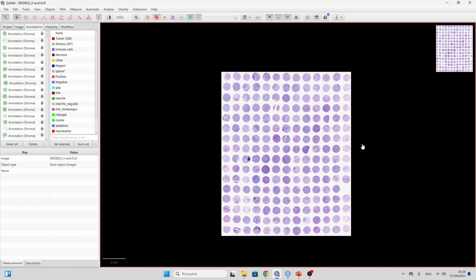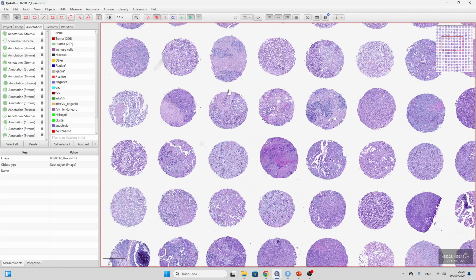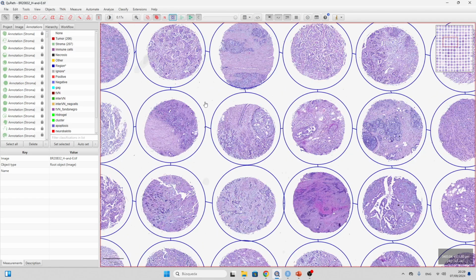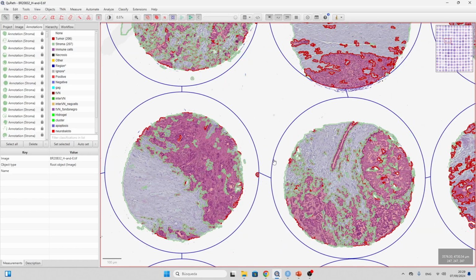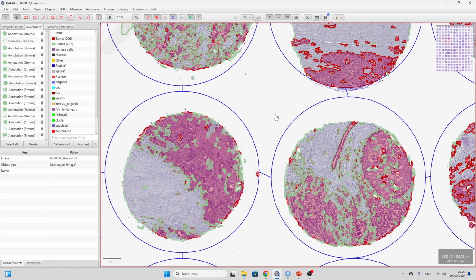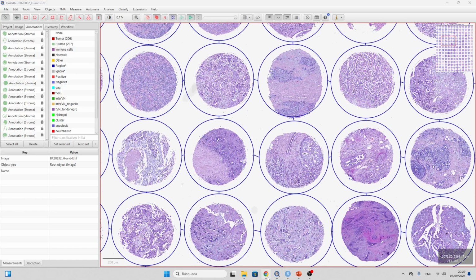In my PhD, sometimes I have tissue microarrays like this one, and my job is to detect the cores and then do some segmentations and then validate these segmentations with my supervisors, right? And this image actually is not from my dataset, it's an open source image.